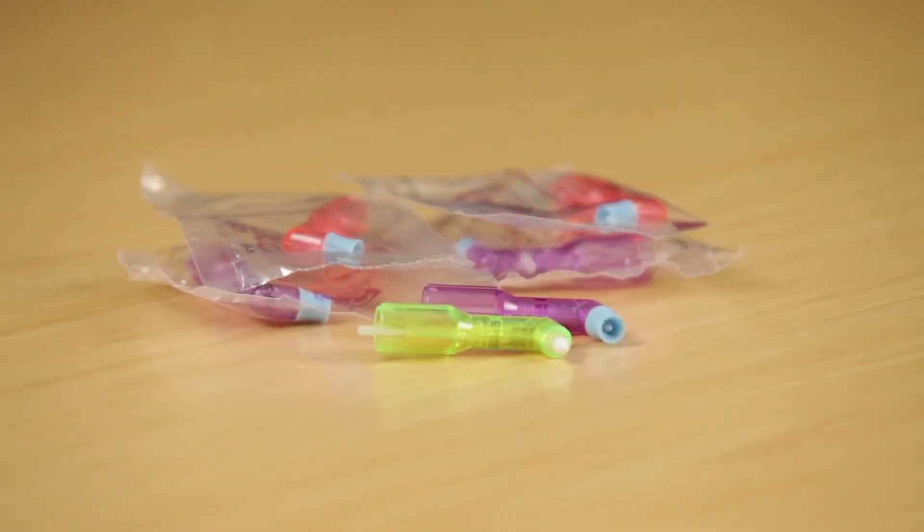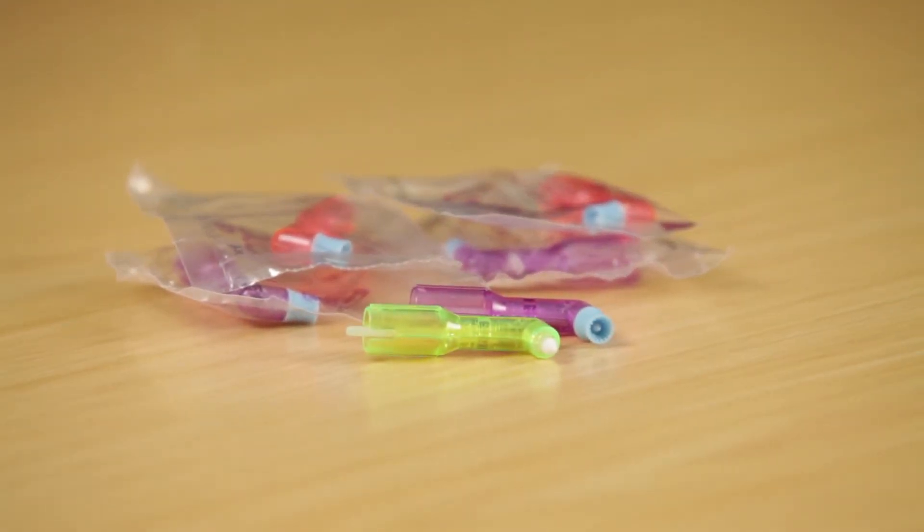My name is PJ Atteberry, and I've been a practicing clinician in dental hygiene for 27 years. I've been using the 2 Pro Prophy Angles consistently now for well over a year. I started using them sporadically just to test them as I received samples and became absolutely addicted to them in my practice.